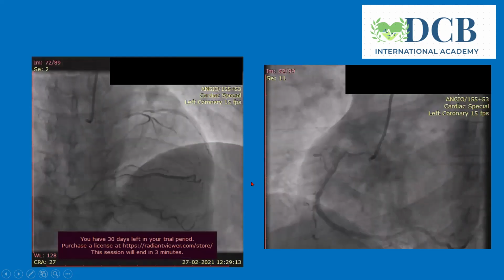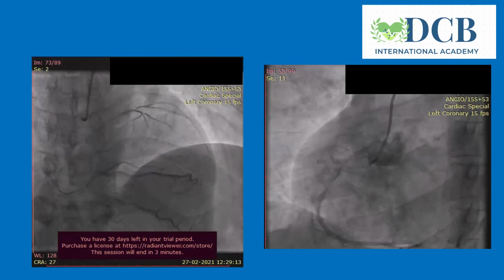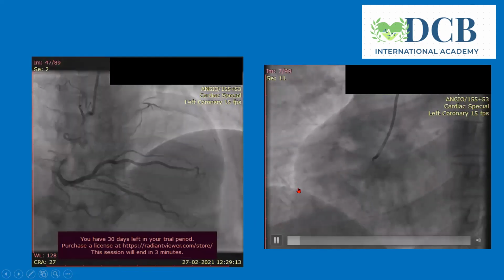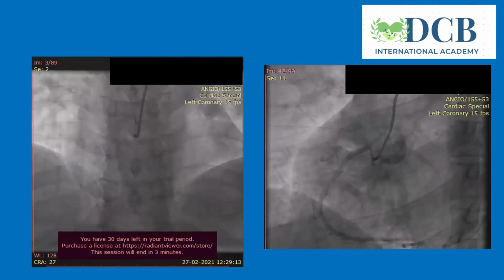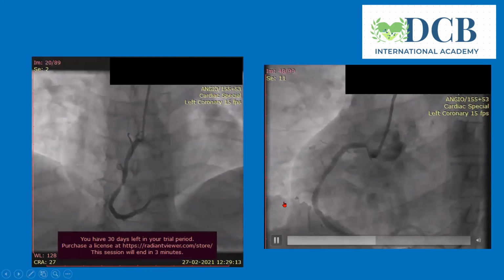Yeah, one thing is that you put the guiding catheter, you put the wire, and then you can decide if to use, if it's not enough, you can decide to use a guide extension. Okay. But you need to improve the quality of the angiogram also before, because I'm not really sure that you should say, okay, I put a longer stent because I didn't see the angiogram very clearly. So this is not the way to go, in my opinion. So you should always have clear angiograms, or you can use a guide extension, you can use intravascular imaging with IVUS, whatever. But before deciding the therapeutic for the patient, that's the most important thing.